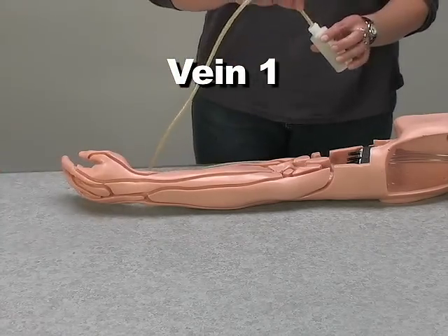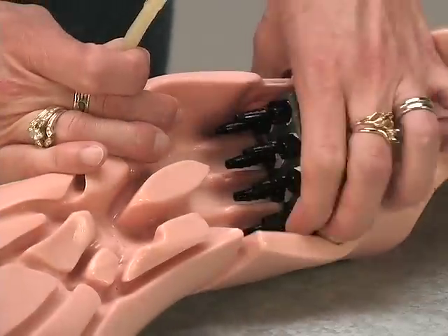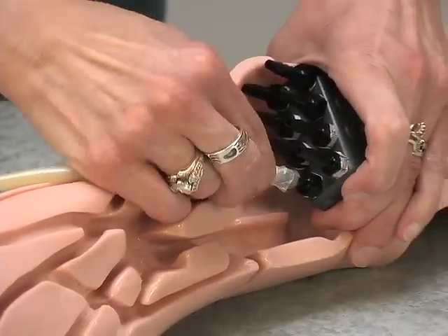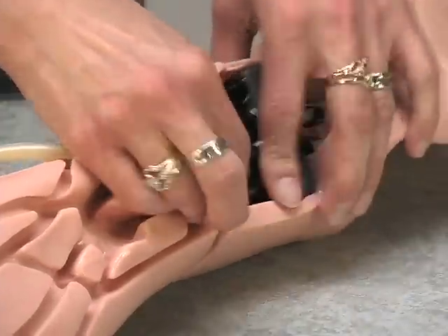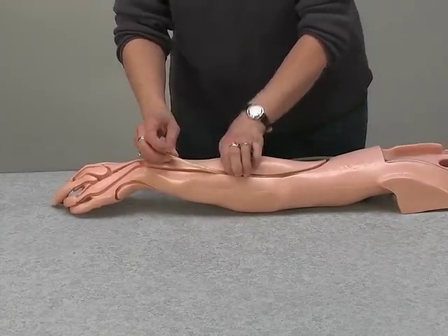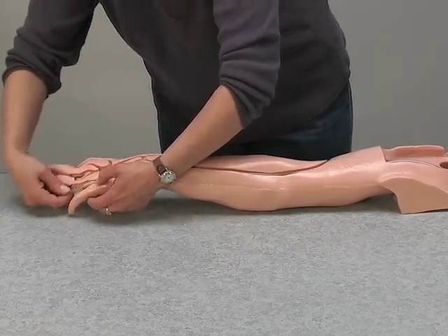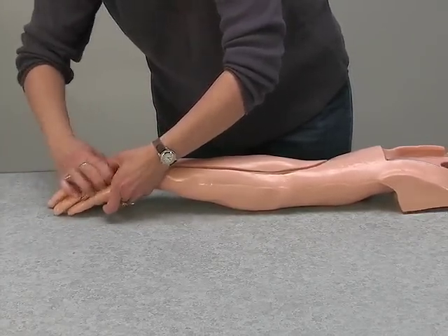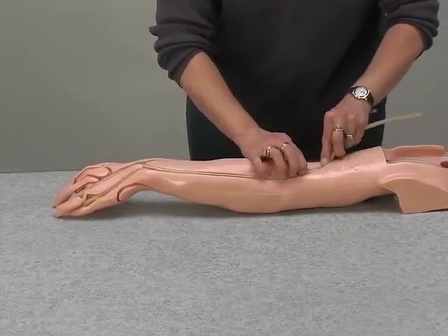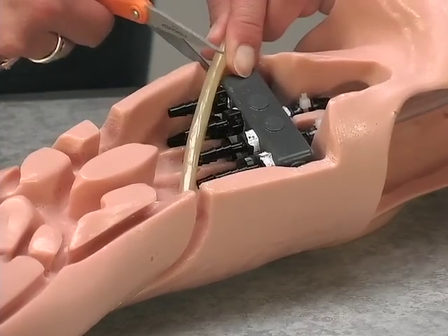Take the first vein and lubricate one end. Connect the end of the tubing into fitting number one. Work the tubing into the channel over the back of the arm, around the third finger from the inside, and back over the arm in the same channel. You will need to trim the excess tubing, being careful not to cut the vein too short.